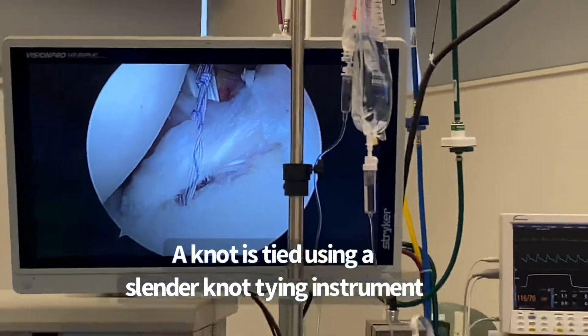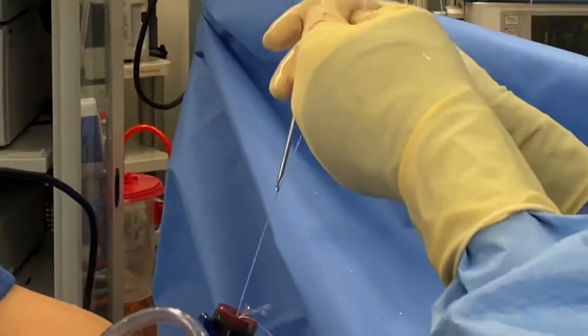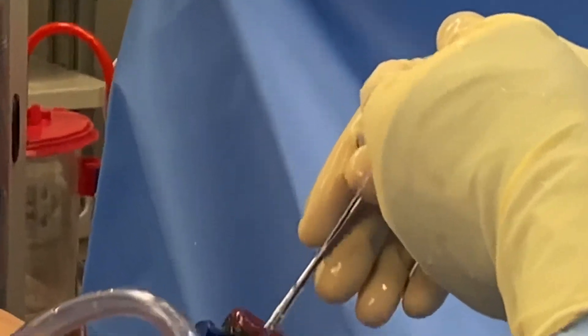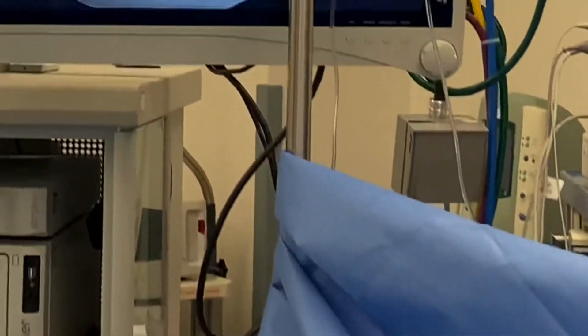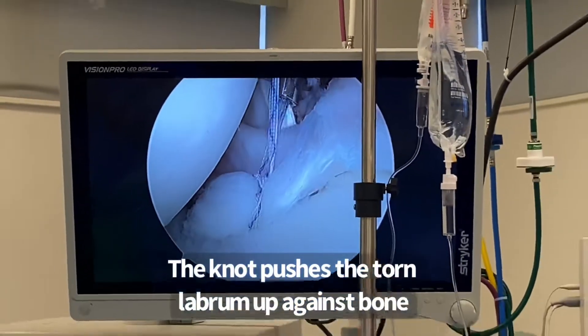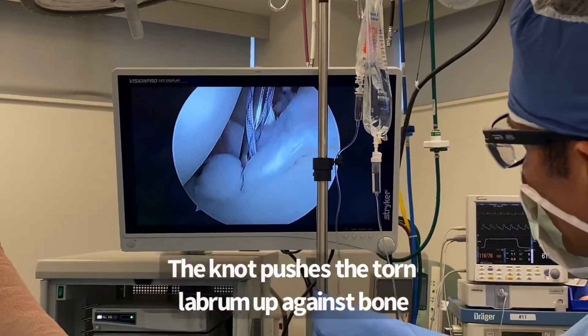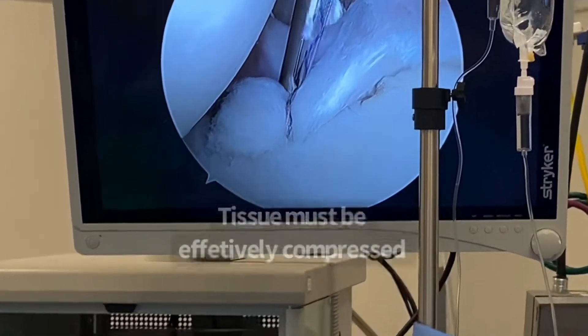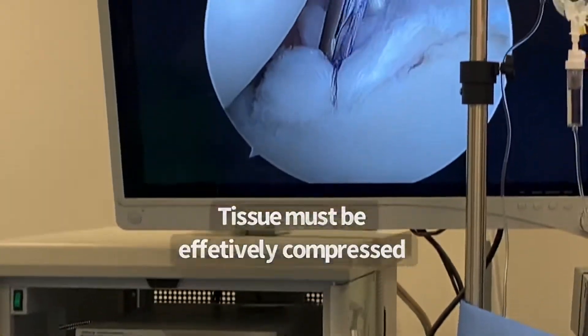I'm going to push down the knots. This is an Iconics anchor from Stryker — very low profile tape — pressing that labrum up against the bleeding bone that was already prepared. I'm going to knock it down just like you do with a surgeon's knot and then locking it down.